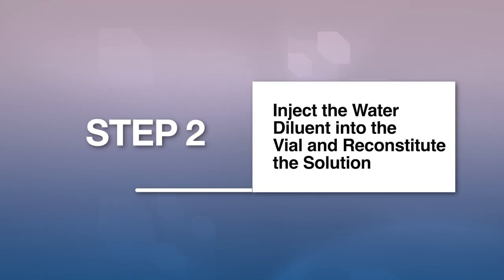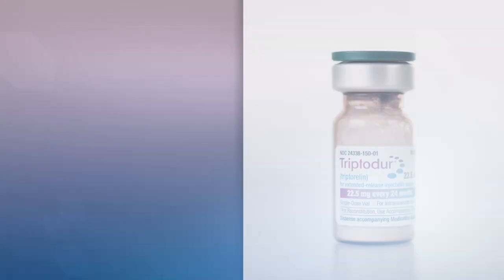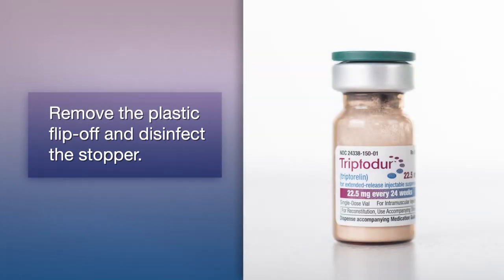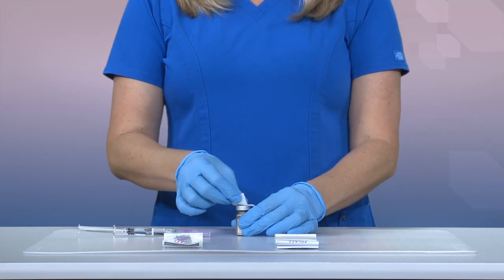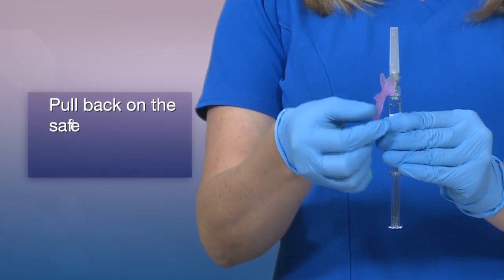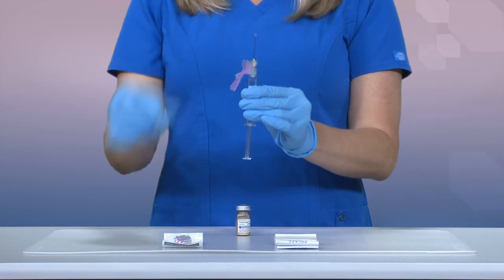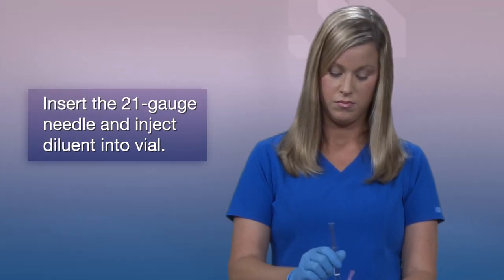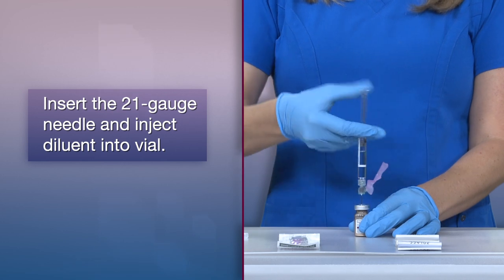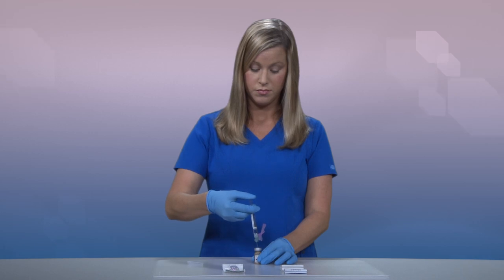Step 2: Inject the water diluent into the vial and reconstitute the solution. Remove the plastic flip-off from the vial and disinfect the visible part of the stopper. Next, pull back on the safety cover toward the syringe and away from the 21-gauge needle. Then pull the clear needle shield off. Once you remove the needle shield, insert the 21-gauge needle through the stopper. Inject the sterile water diluent into the vial, ensuring the diluent rinses the sides of the vial.